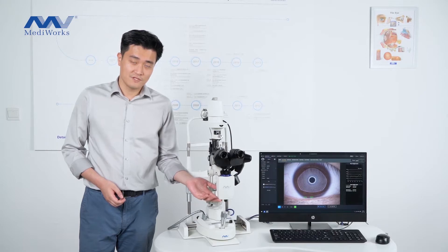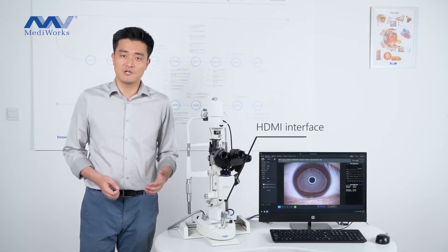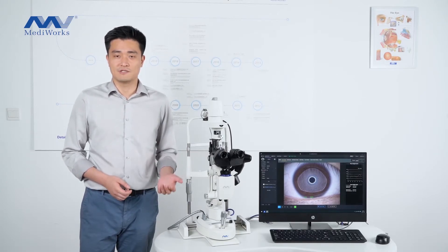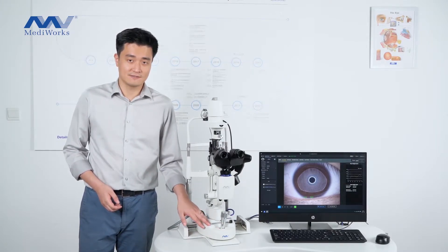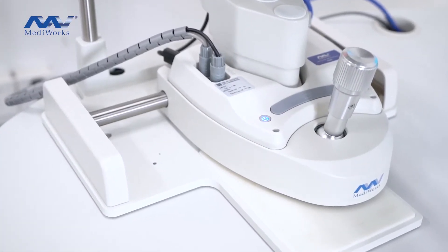At the bottom of the camera module, there is an HDMI connection interface, and it can connect with the monitor. The power supply box is integrated in the base, and that makes the installation of the slit lamp quick and easy.